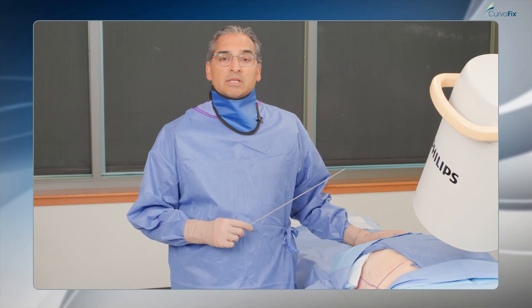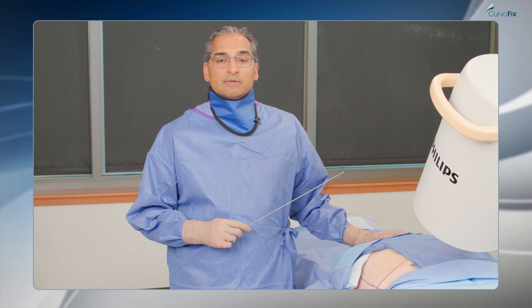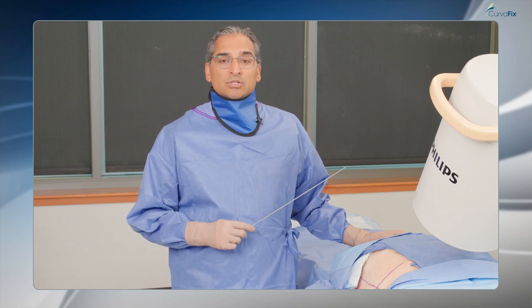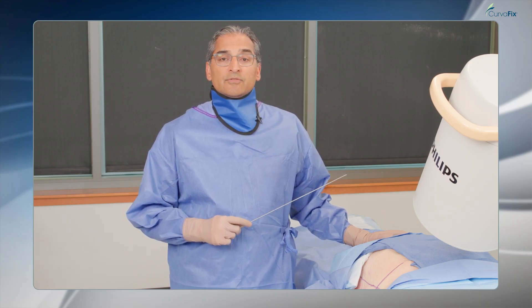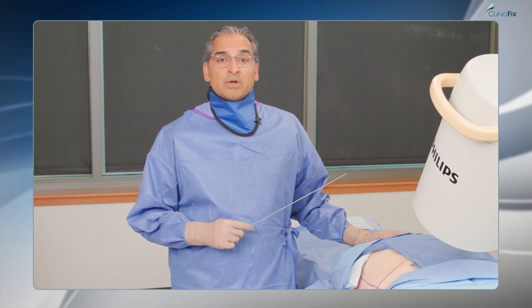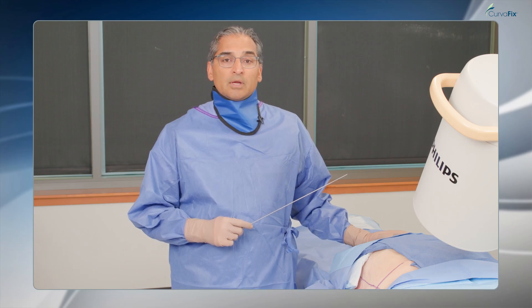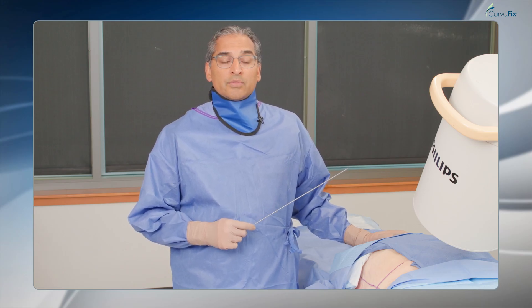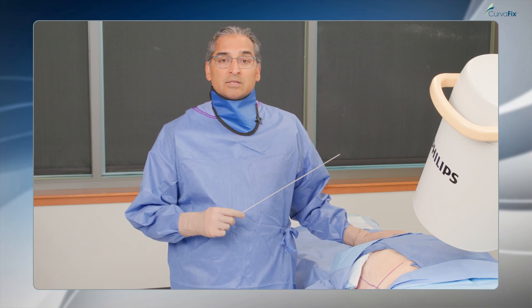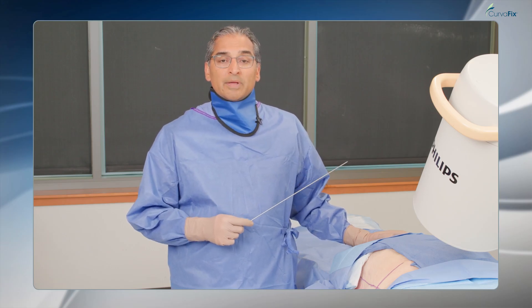One of the uses of a CurvaFix is in the dysmorphic posterior pelvic ring where you want upper sacral segment fixation. Another potential application is the use of a CurvaFix device in the upper sacral segment for patients who have fragility fractures or sacral insufficiency fractures of the posterior pelvic ring. In poor quality bone, the CurvaFix screw, particularly as it undulates through the posterior pelvic ring, provides tremendous stability.